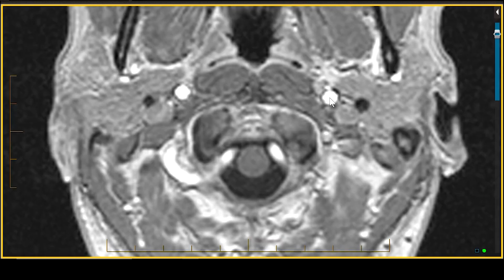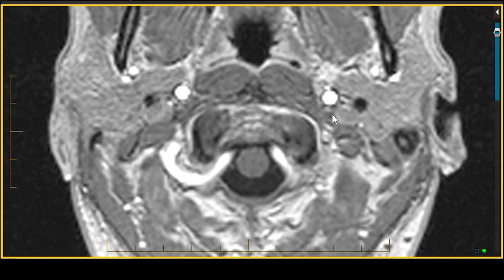I've got the internal carotid artery. I can't see the external branches all that well, and I'm not down to the level of the common carotid artery yet, but that's relevant. So keep these two structures in mind.